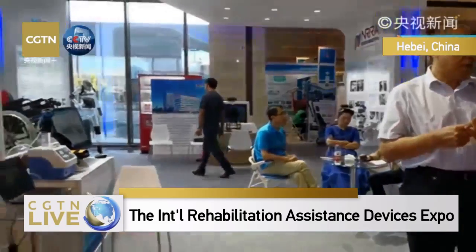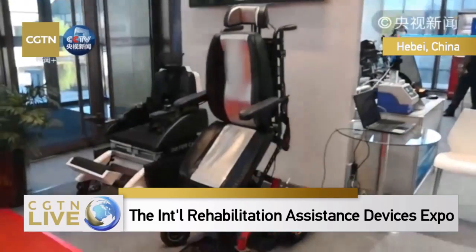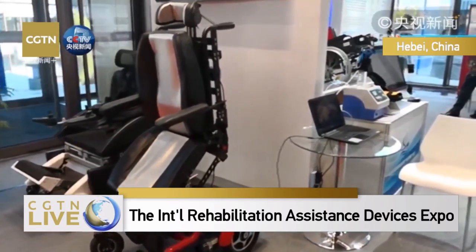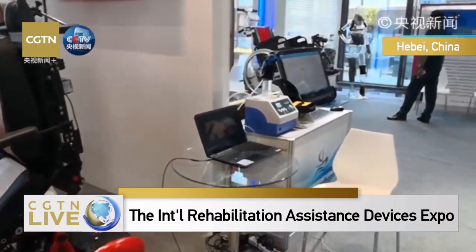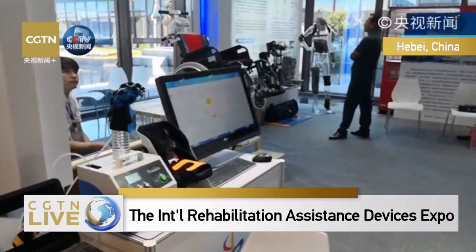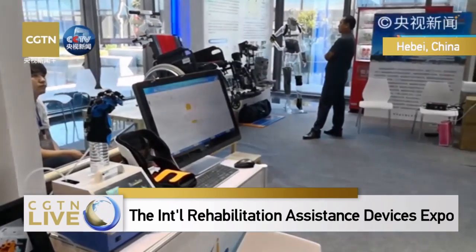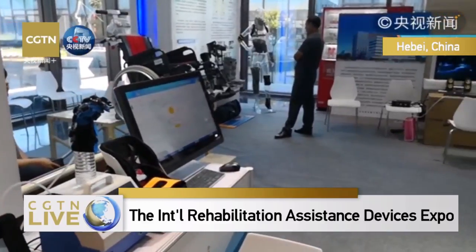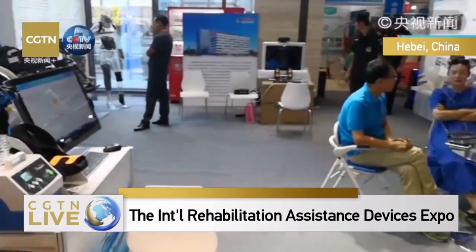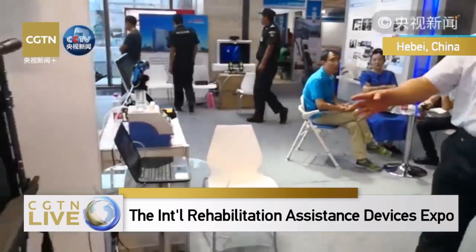The rehabilitation assistant devices mainly provide services for three kinds of people: the senior citizens, the physically challenged people, and those with mobility diseases. And it serves as a supplement, a substitute, or assistance. Can you elaborate on that? According to national standard, there are altogether 12 categories, and currently we have about several thousands of devices.